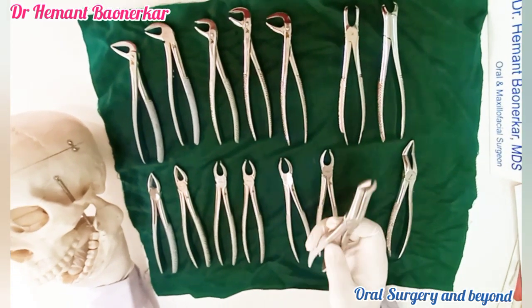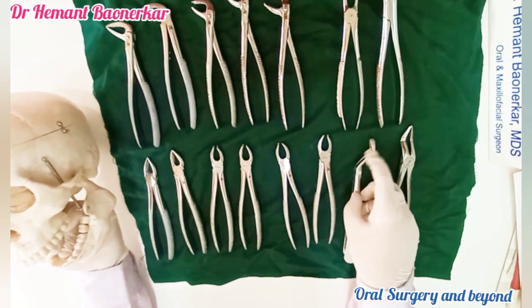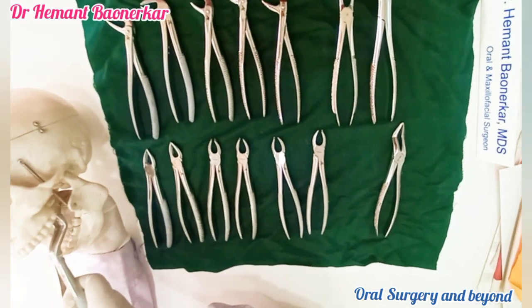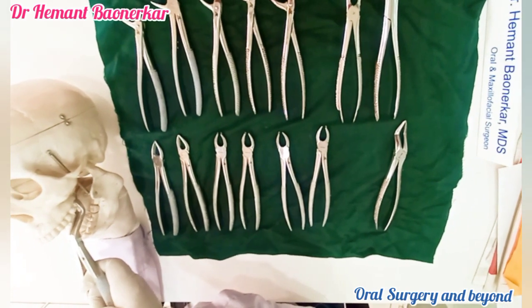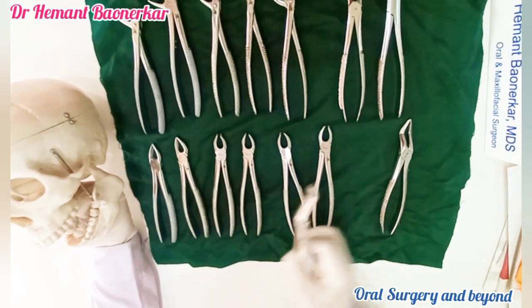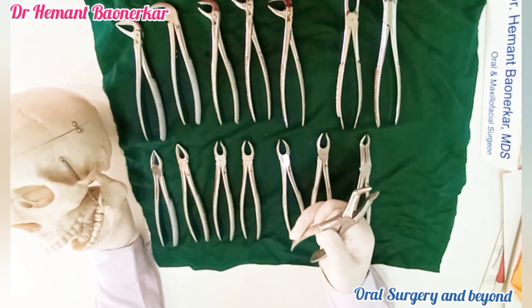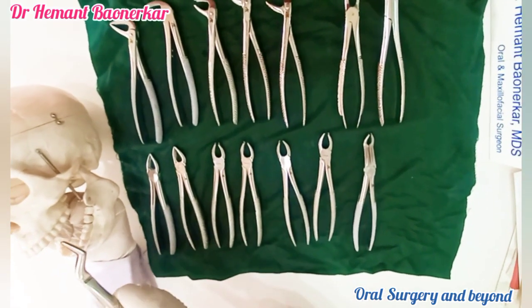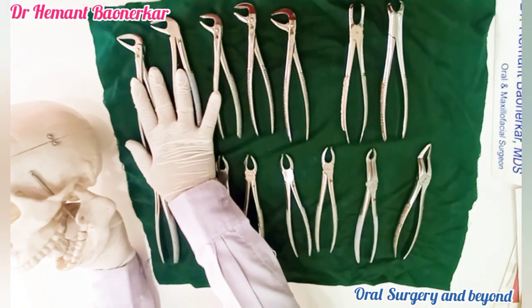This is the maxillary third molar forceps. We can identify it by its typical angulation, which allows the forceps to go deep to reach the maxillary third molar, hold it, and help extract the tooth. This is called the maxillary root piece forceps or bayonet forceps, mostly used for single root extraction. That covers the maxillary forceps.